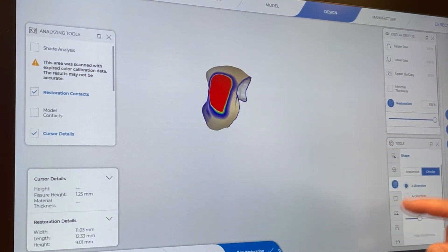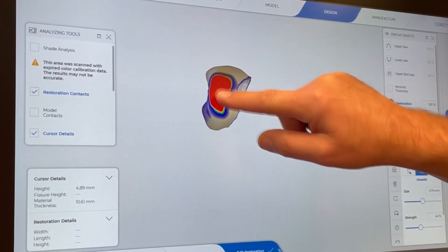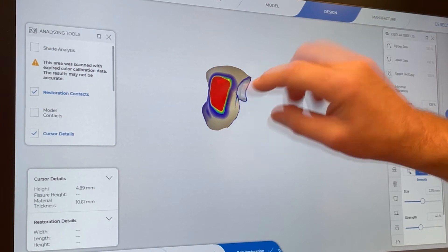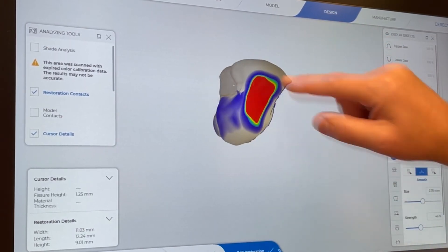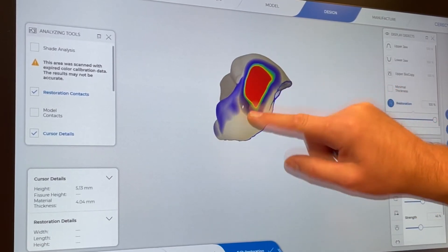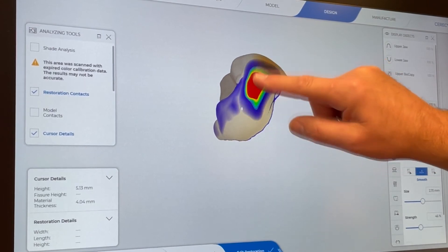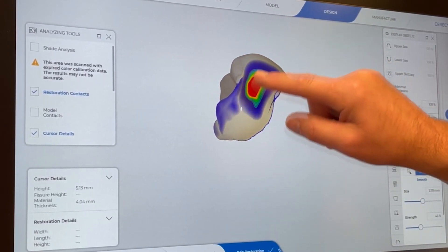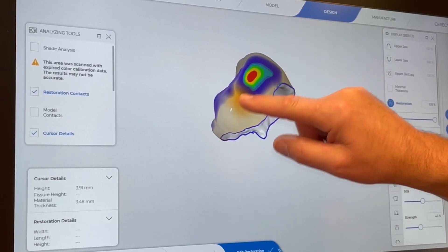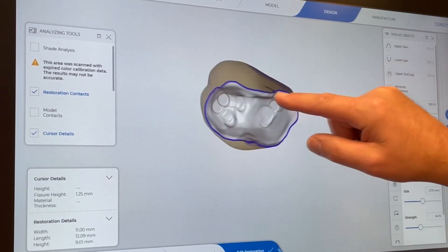Now switching to the form tool — we can add on the margins, subtract wherever it's overly bulky. Using the touchscreen and the smooth tool, I'm bringing the contact down from the red that was created by building out the embrasures — rounding it back into just a slight yellow for the contact point. The more you build out your embrasures, the more red you'll end up with in that zone, so you smooth it back down. We're getting close now — rounding the corners, getting a nice tiny bit of yellow on the upper last molar.